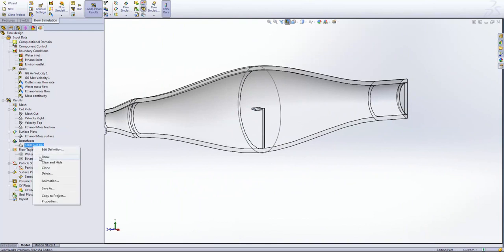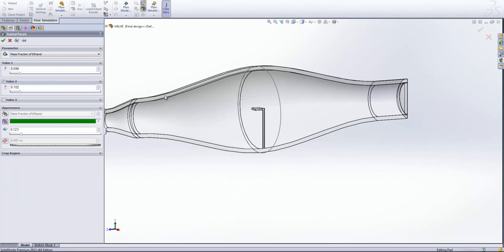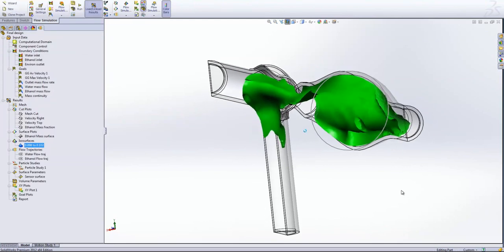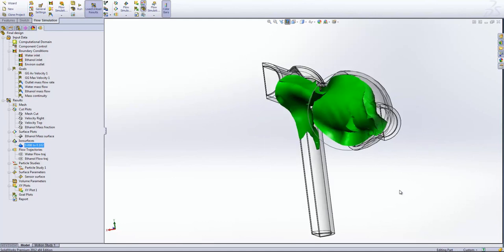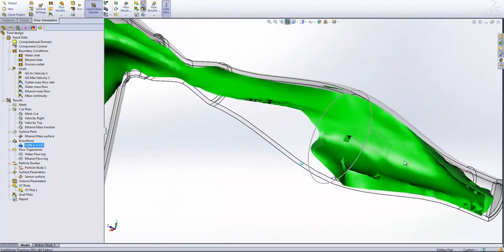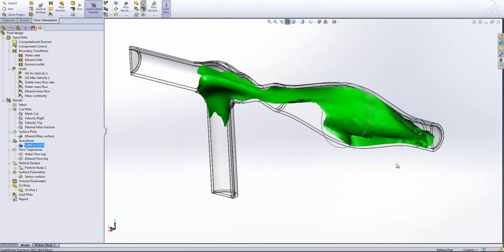Okay, one tool that we're going to have a look at here, which we didn't see previously, is the iso surfaces tool. What this allows us to do is plot a surface at each of these values that we're inputting here. So I'm going to put one at 0.002 below the mass fraction that we're after, and another one at 0.002 above the mass fraction we're after. What this is going to do is generate an envelope inside which the mass fraction value is plus or minus 0.002 of ethanol. So what you'll see is that our sensor is encased within this envelope, which tells us that we've got a much, much better design, and that sensor will be reading that 0.1 that we are after.